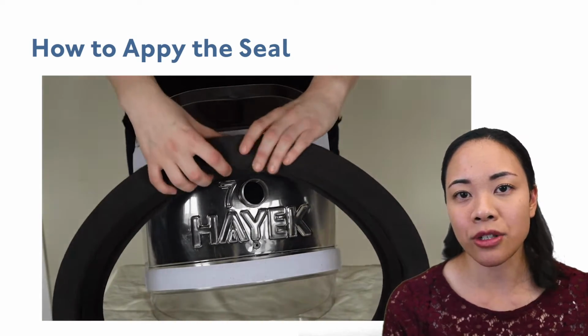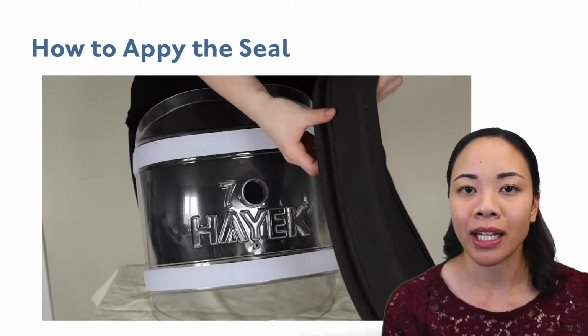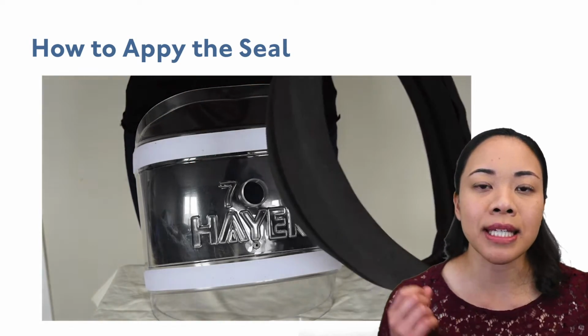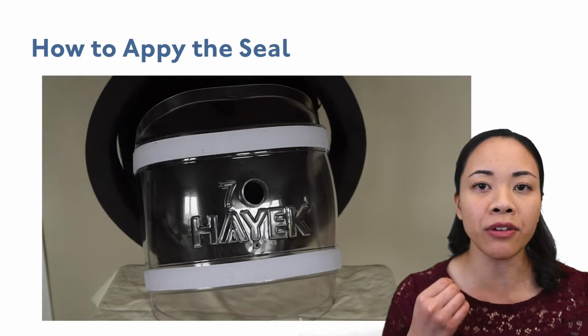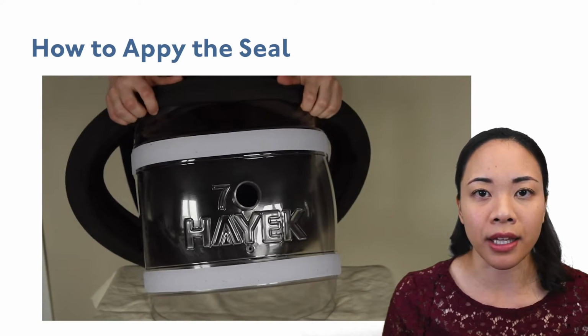Step 1. When fitting the seal to the Cuirass shell, place the seal's joint seam at the center top of the Cuirass. The Cuirass should be upright, facing away from you. The side of the seal with double padding should be proximal to you. Locate the inner flap on the distal side of the seal. This circumvents the outside of the Cuirass.